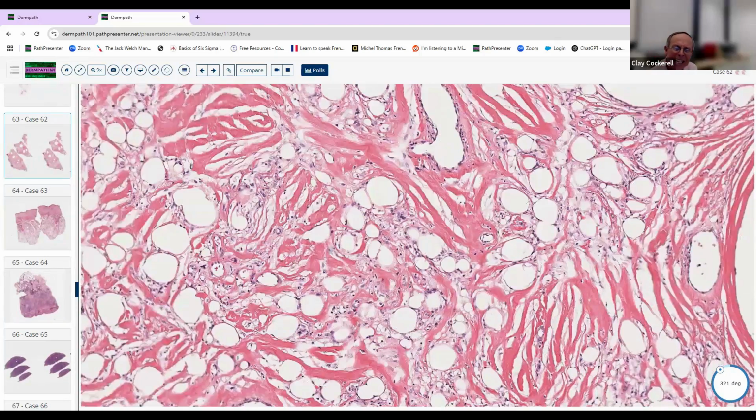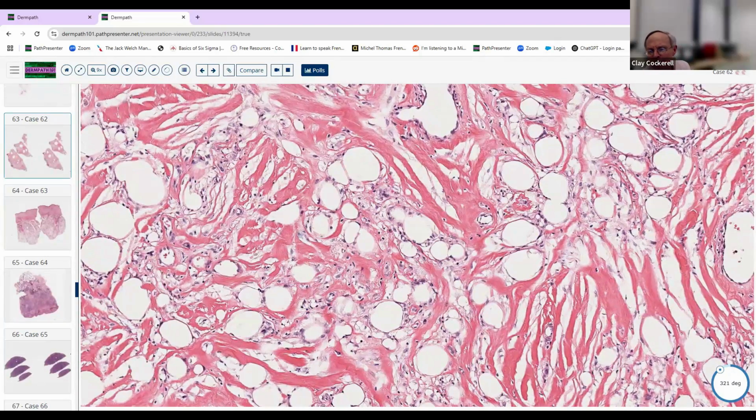It doesn't look like any of the classic inflammatory skin diseases that we look at in the textbook. And so we start looking and say, well, look at these choices. Suture granuloma? No way. This is way too dense. It's got the scar tissue. It's got all these granulomatous areas with foamy cytoplasm. It's got these large fat microcysts.